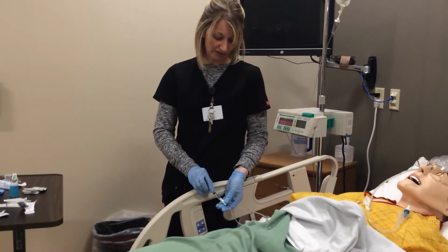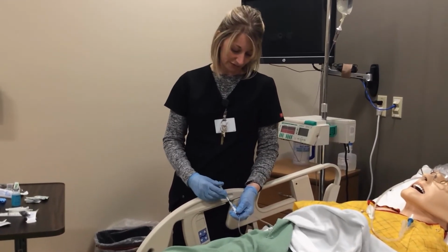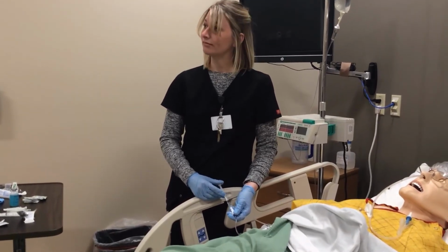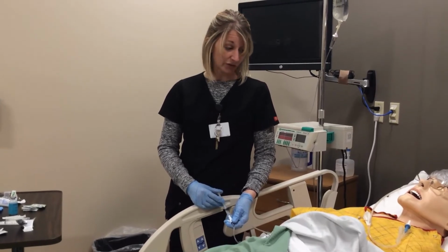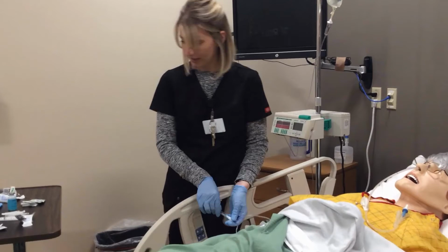Like I said, usually during this time you have some meaningful conversation with your patients, talk about stuff. You learn a lot about them. All right, so for sake of time for me, we're going to say it's been 3 to 5 minutes, and I've pushed my medication through, okay?